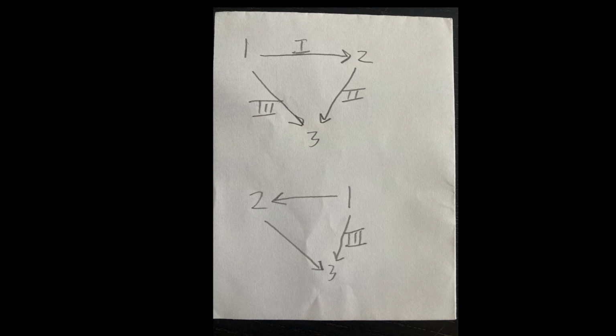Until this point, you're just doing pattern recognition, but when you can tease this stuff out, when you can sit down and draw out the triangle and figure out what happened and troubleshoot based on what you're seeing just on the EKG and not on what the leads actually look like, that's when you know you really understand it. So you may not understand it right now. That's okay. Keep working on it. Draw this stuff out. Think about it hard, and it'll become clear. Hell, it only took me 10 years of being a doctor to figure that out, and I just now figured it out.